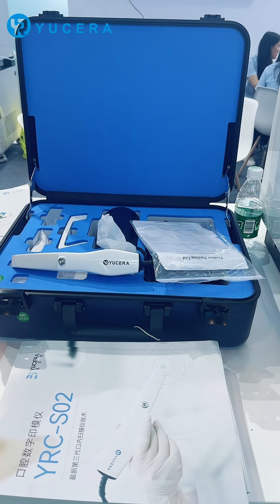And third, the scanning speed is very fast. A full mouth scan takes about 1 minute. And this is our oral scanner. If you are interested in it, you can leave us a comment, and we will send you the latest catalog right away.